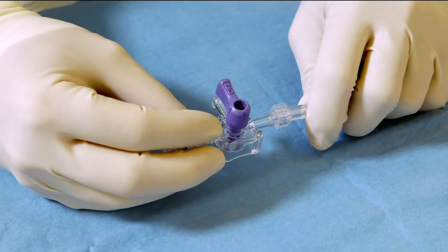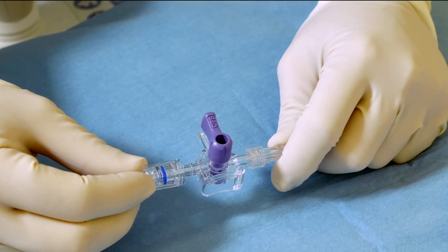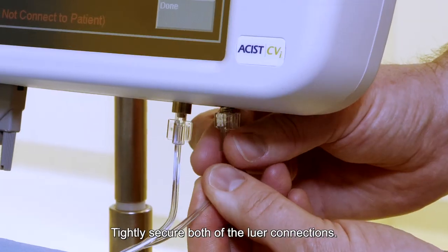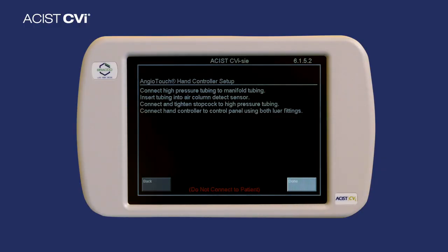Step 3. Attach the stopcock to the distal end of the patient tubing. Step 4. Attach the hand controller luer connections to the control panel. Tightly secure both of the luer connections. Press Done.